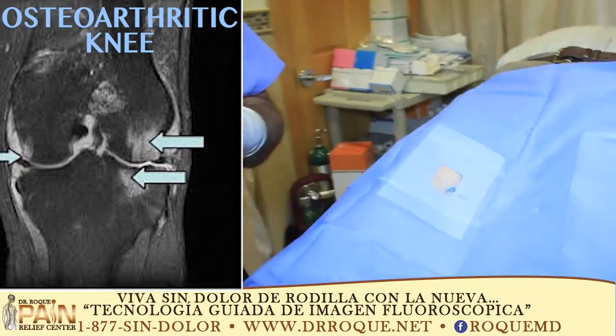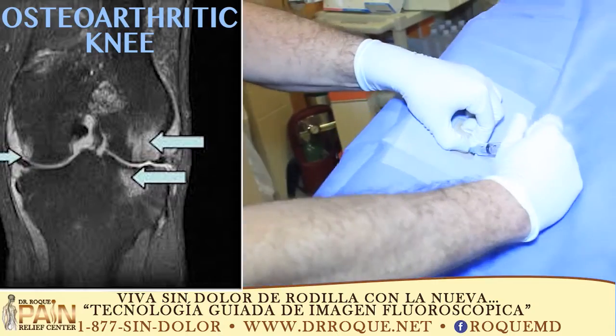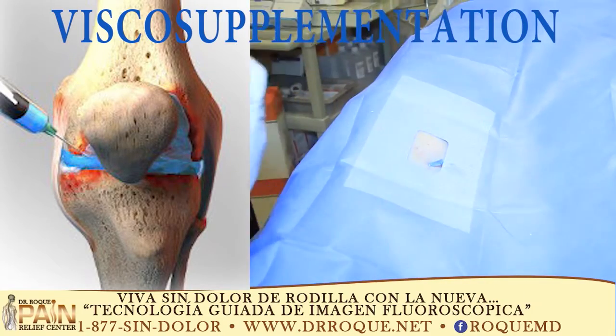How was that? Not bad right? Alright, so now I'm going to put the dye in, and then we're going to take a look — you tell me if it's this. Hold on a second, let's see the kick shot.